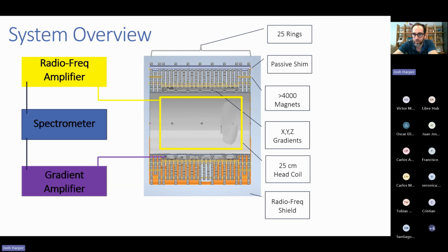And then of course we've got radio frequency shielding that we use. That's important to point out, I suppose, now, because there's a lot of systems that use sort of artificial intelligence to remove noise automatically. We're not doing that at the moment. We just use the old-fashioned shielding because it seems to be fairly robust.